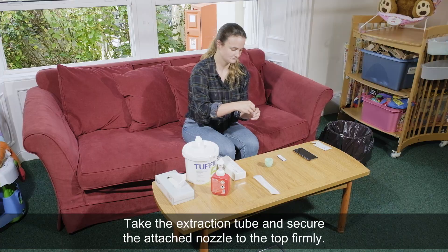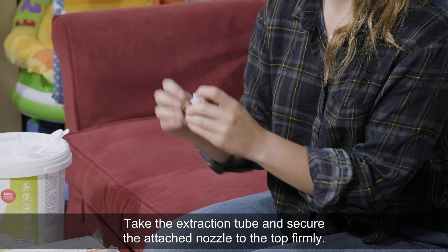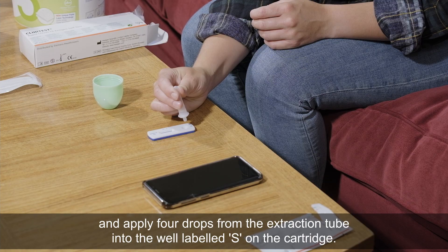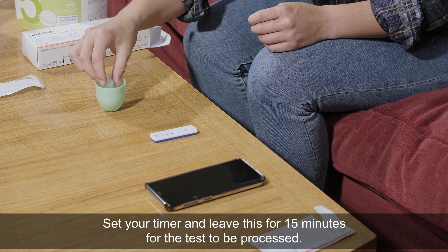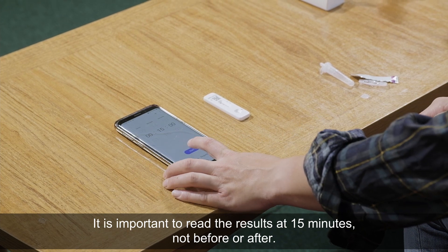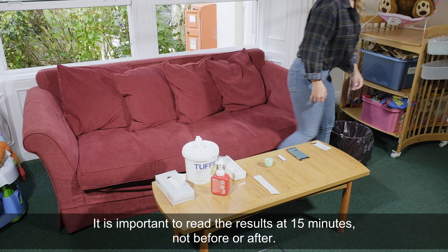Take the extraction tube and secure the nozzle to the top firmly. When you're happy that it is secure, hold the dropper vertically and apply four drops from the extraction tube into the well labelled S on the cartridge. Set your timer and leave this for 15 minutes for the test to be processed. It is important to read the results at 15 minutes, not before or after.